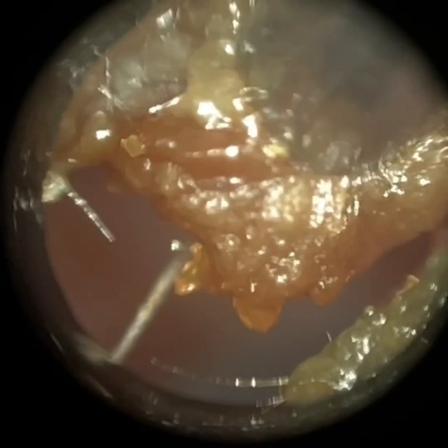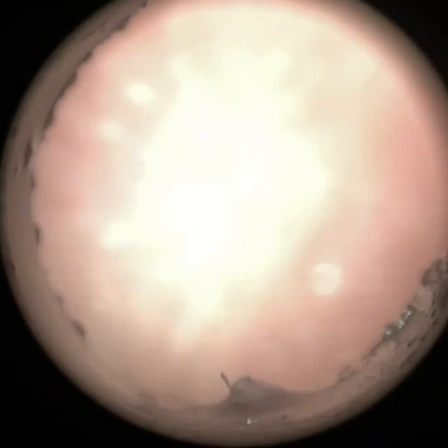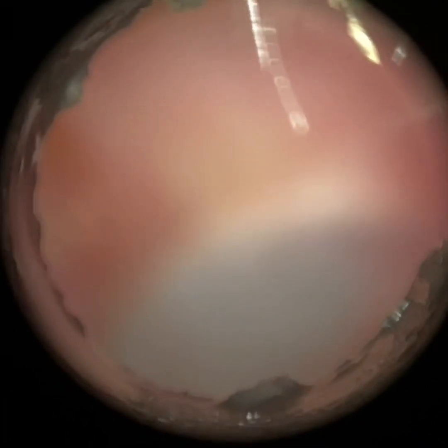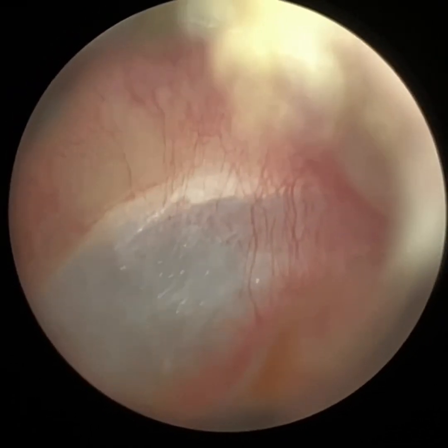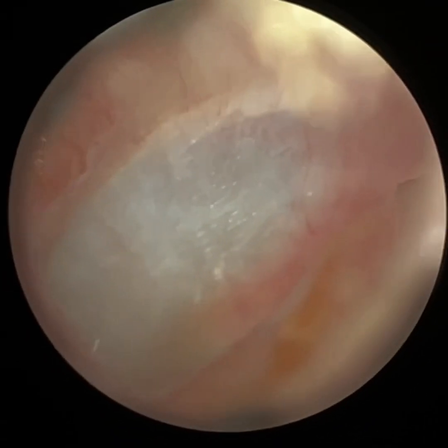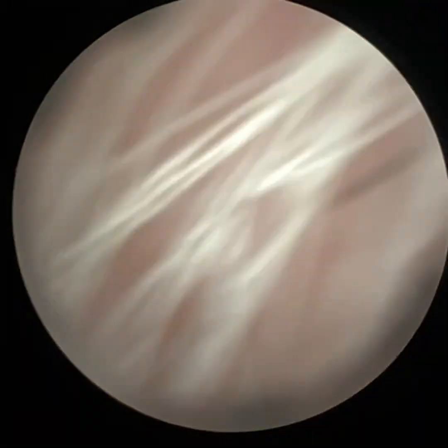Slowly but surely, we're getting there. There's a bit of skin adhesion here as well — you can see on the periphery that white textured skin. I'm really stretching it. I've got the right-hand side of the speculum past the second bend, but we can only just see the hammer bone. You can't see the light reflex. The anatomy is also the same in the left ear.